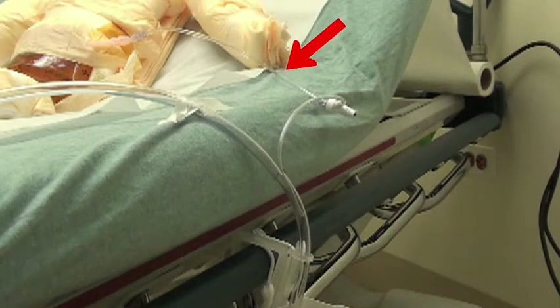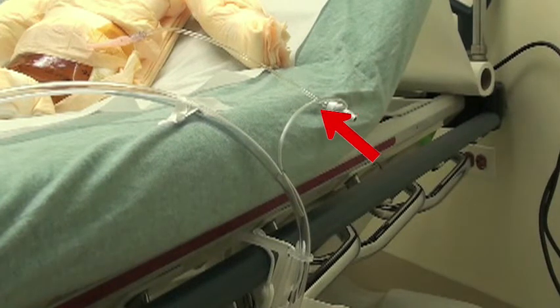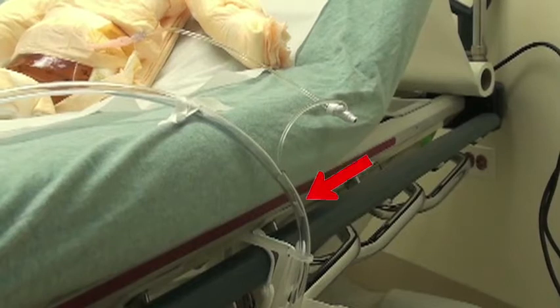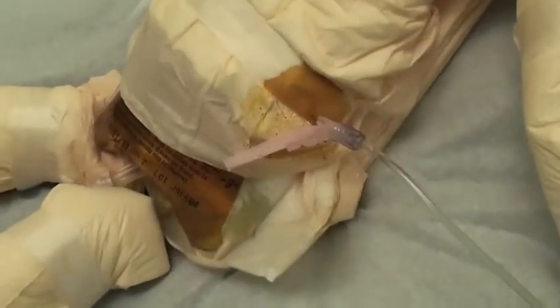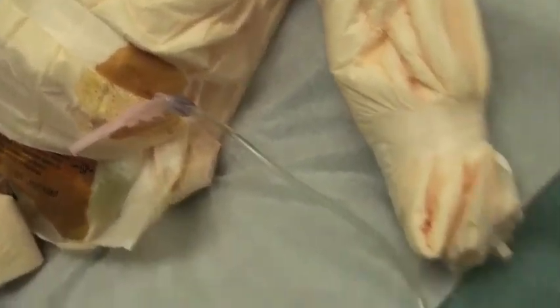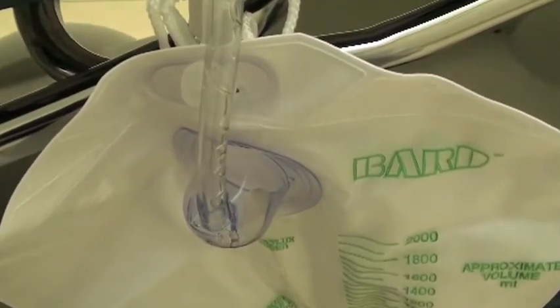It's a little hard to see here but follow the arrow — there it goes. Here is an overview of the whole system. You can see the needle in the abdomen and the IV tubing connecting to the hole in the Foley tubing, and there's ascites collecting in the Foley bag.